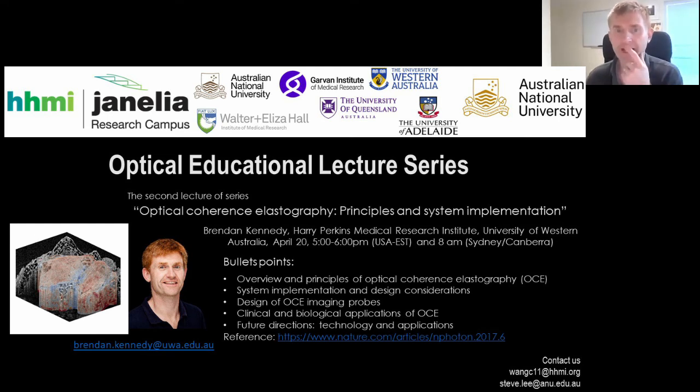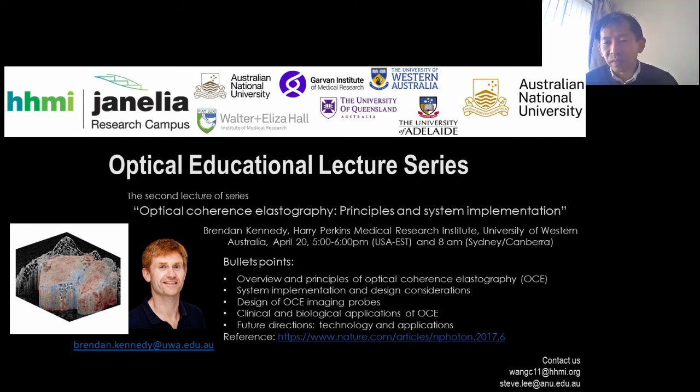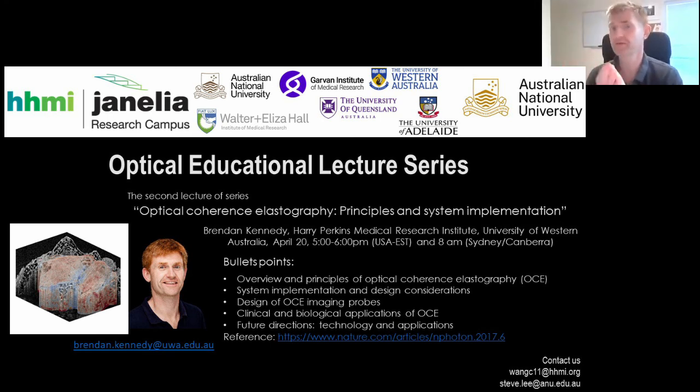Working backwards, axial resolution, and can we improve it, I think was another question. Yeah. So again, the three components of axial resolution are the OCT system. If we go to higher resolution, we make the speckles smaller. When the speckles are smaller, we can proportionally reduce the fitting range. So that's one way to improve the system resolution. Again, it's the dark speckle that limits our ability to accurately do that linear fit.